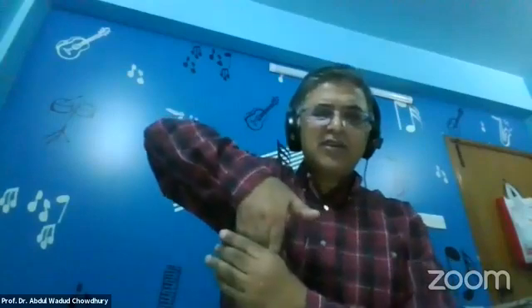As Shahabuddin Bhai was saying, it helps. How? Number one, the axis first points you to whether you have done the ECG properly. If it is negative, why is it negative? Is it truly negative or is it created negative? That means limb lead transposition. Second, if there is any chamber enlargement, is it really right ventricular hypertrophy? A tall R in V1 associated with a negative QS complex in lead 1 means right axis deviation. The main current, because of the increased muscle mass of the ventricle, has shifted from the left ventricle towards the right. And that's why the negative QS complex helps in establishing your diagnosis.